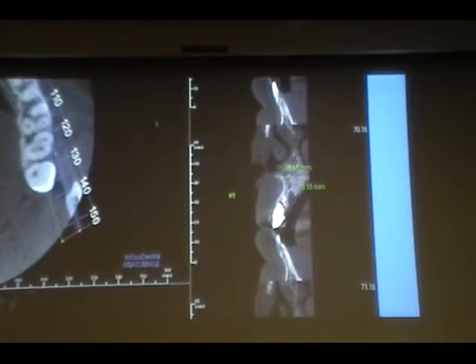Yes, exactly. So remember, I told you it is the nasopalatine foramen. If you're looking at that, it's like a rail track kind of appearance, straight up. Do you see that pattern? First of all, that's what you have to check. So if you see here, as you guys noted, not enough bone is present because there's some kind of little divot or defect present. So now, is it an enlarged foramina or is it pathology?